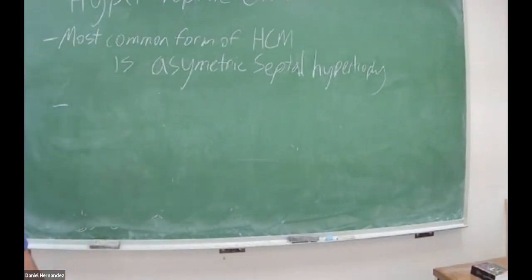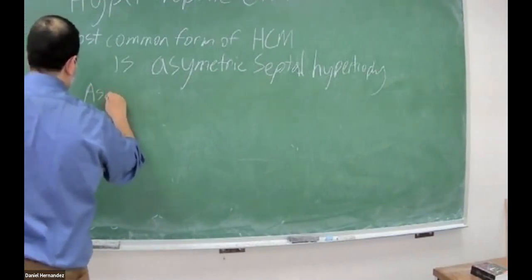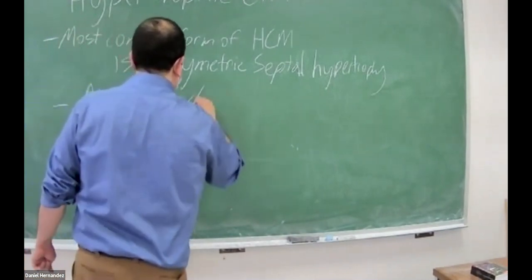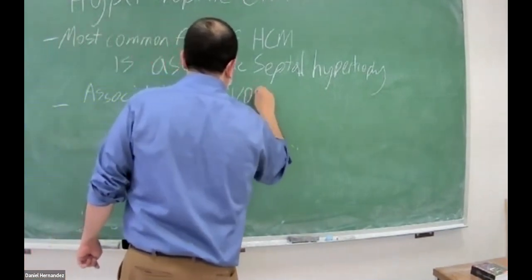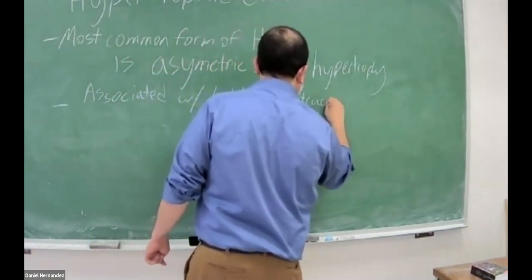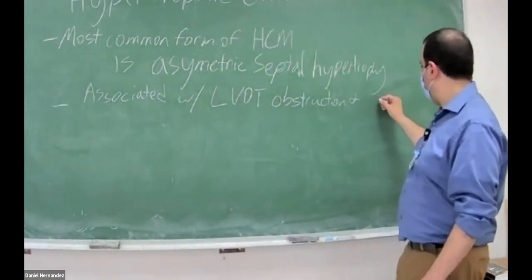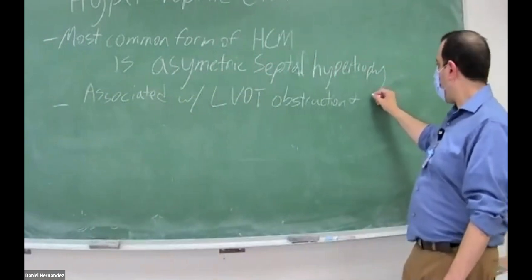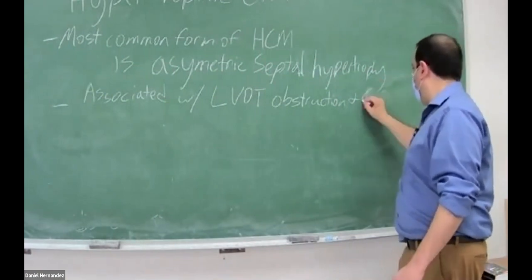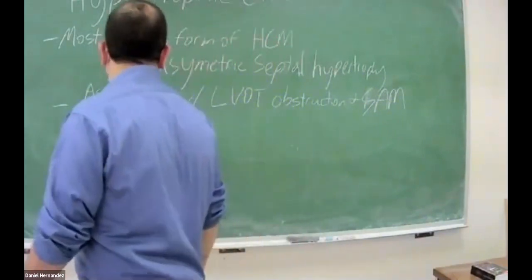This is associated with LVOT obstruction and SAM, systolic anterior motion of the mitral valve leaflet.